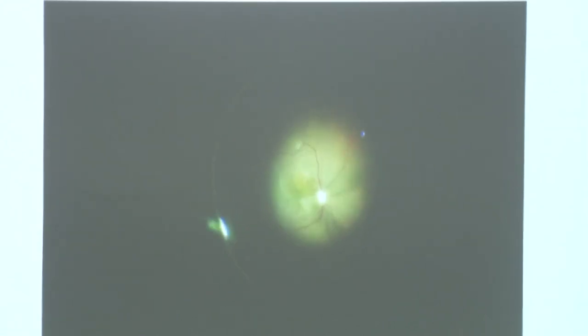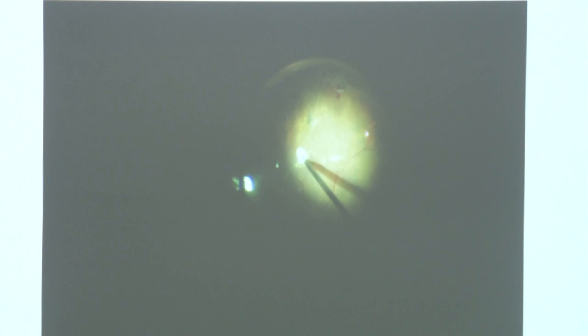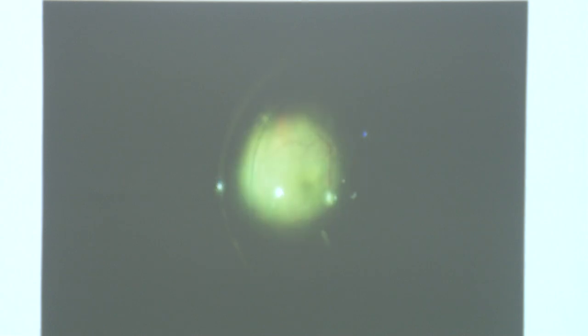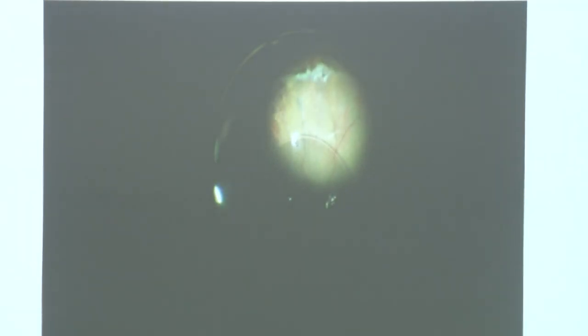This is another case of failed retinal detachment surgery — a traumatic retinal detachment that was operated but unfortunately didn't reattach, with epiretinal membrane over the retina and a subretinal fibrous band behind it, along with extensive proliferative changes. We performed a retinotomy to remove the subretinal band, grasped it with forceps and removed it, then put PFCL, stained the ILM and ERM over the macula, and removed them. Taking care of proliferative tissues both behind and over the retina, followed by silicone oil tamponade, led to excellent outcome with retinal attachment.